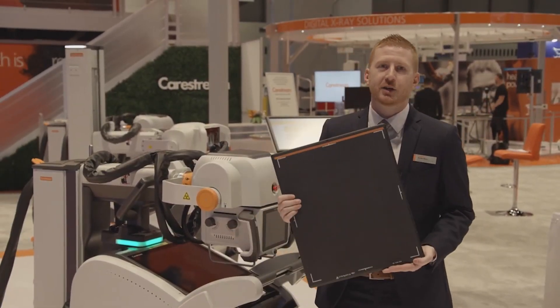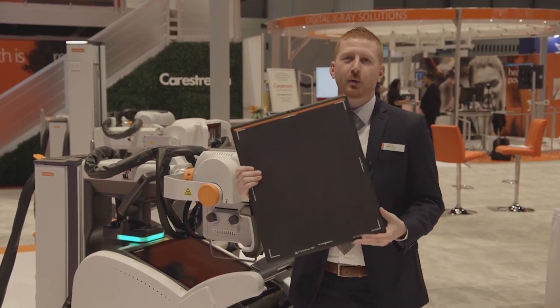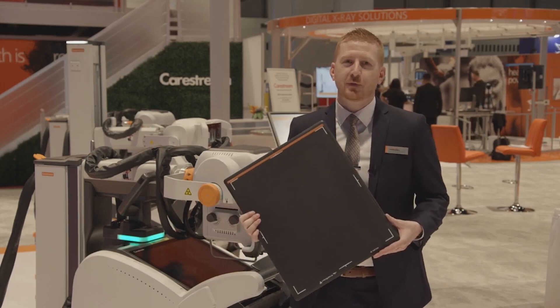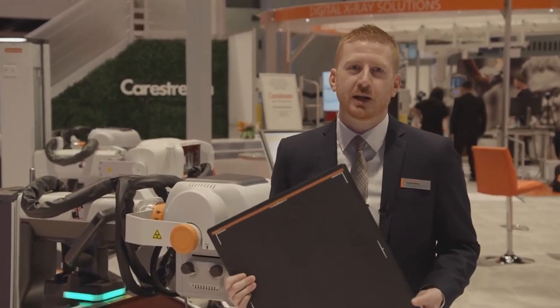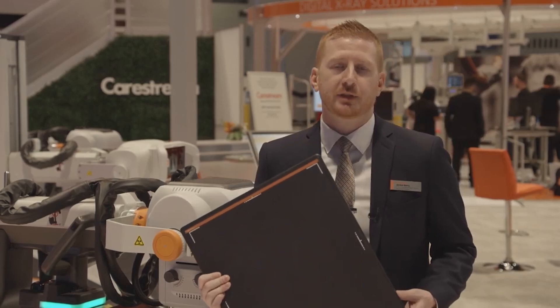The LUX35 detector is our first glass-free detector in the medical space. It weighs almost two pounds lighter than our DRX Plus detectors, so it's ideal for mobile imaging. That two-pound weight reduction can make a huge difference for technologists, helping to alleviate stress and strain for those carrying this detector around all day to provide mobile examinations for your facility.